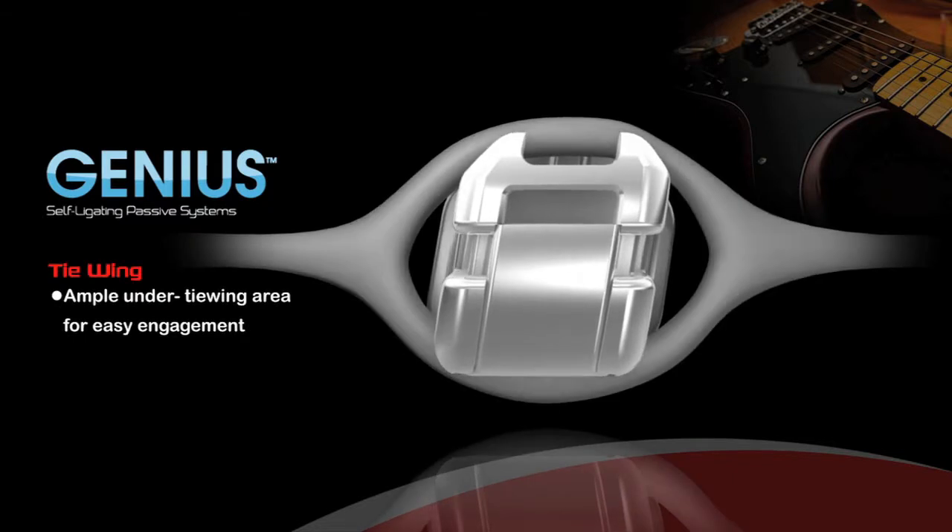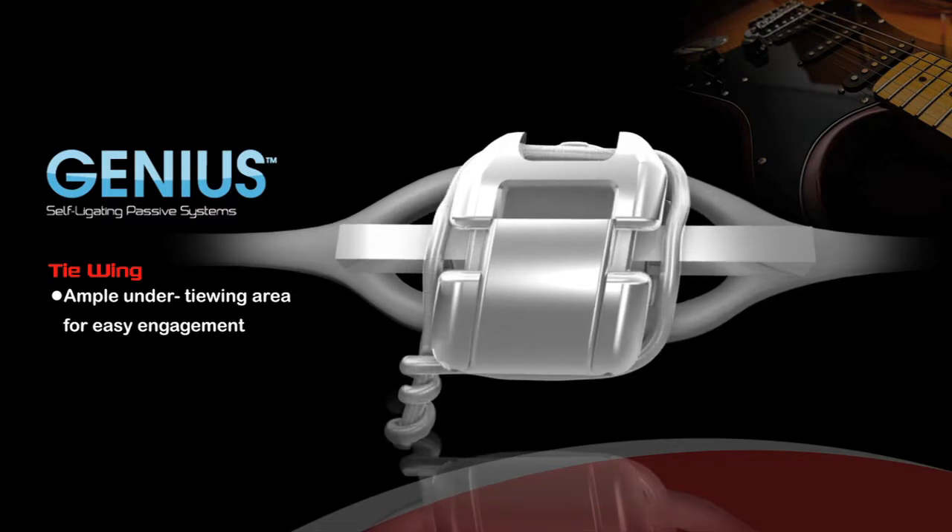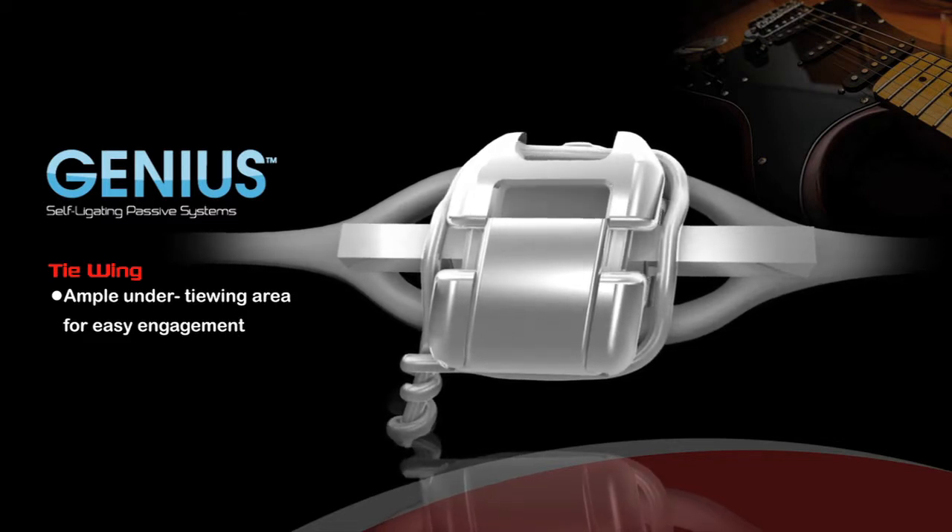Tie Wing: Genius is engineered with an ample under-tie wing area that allows orthodontists to place the power chain or other ligating mechanism.